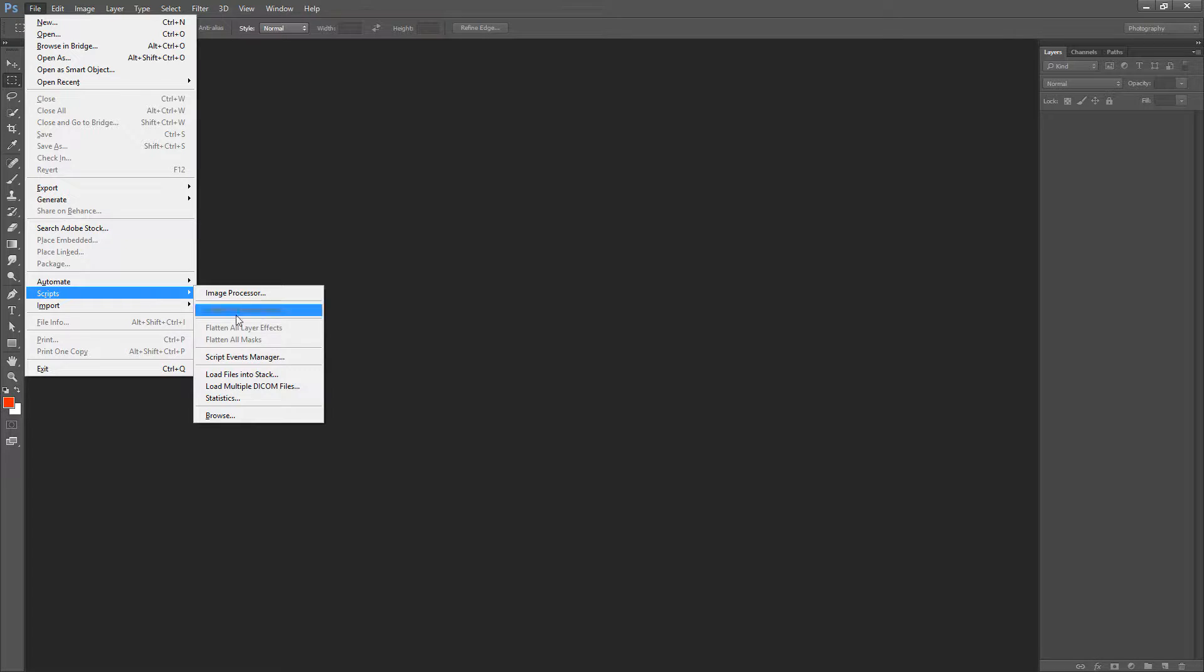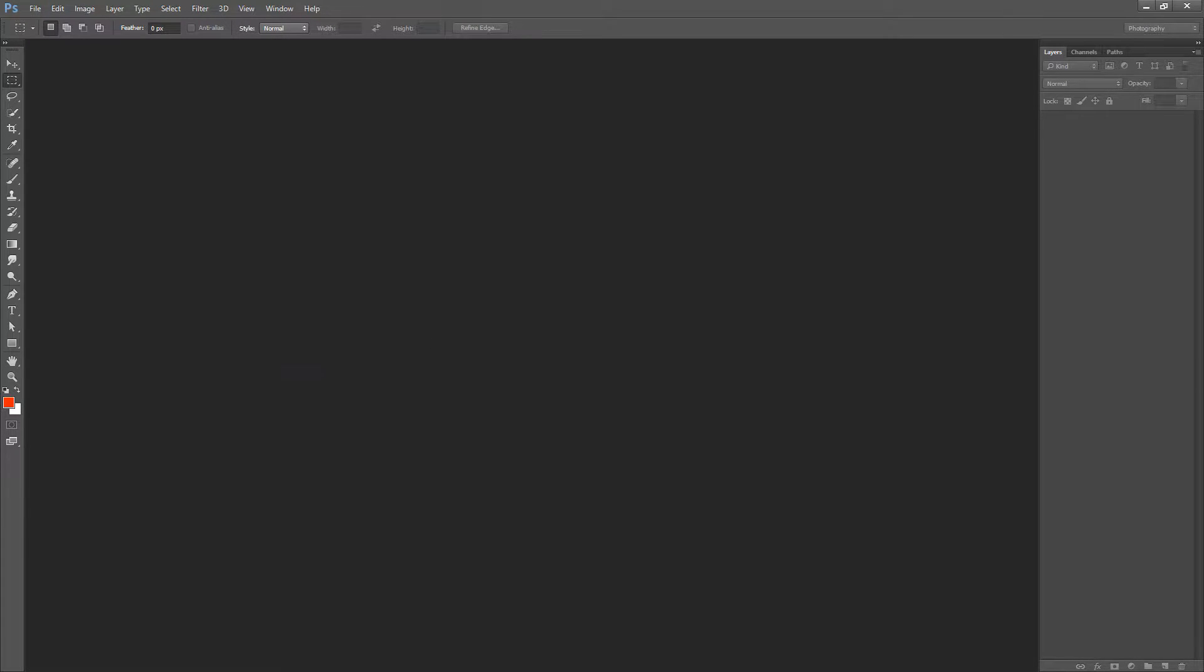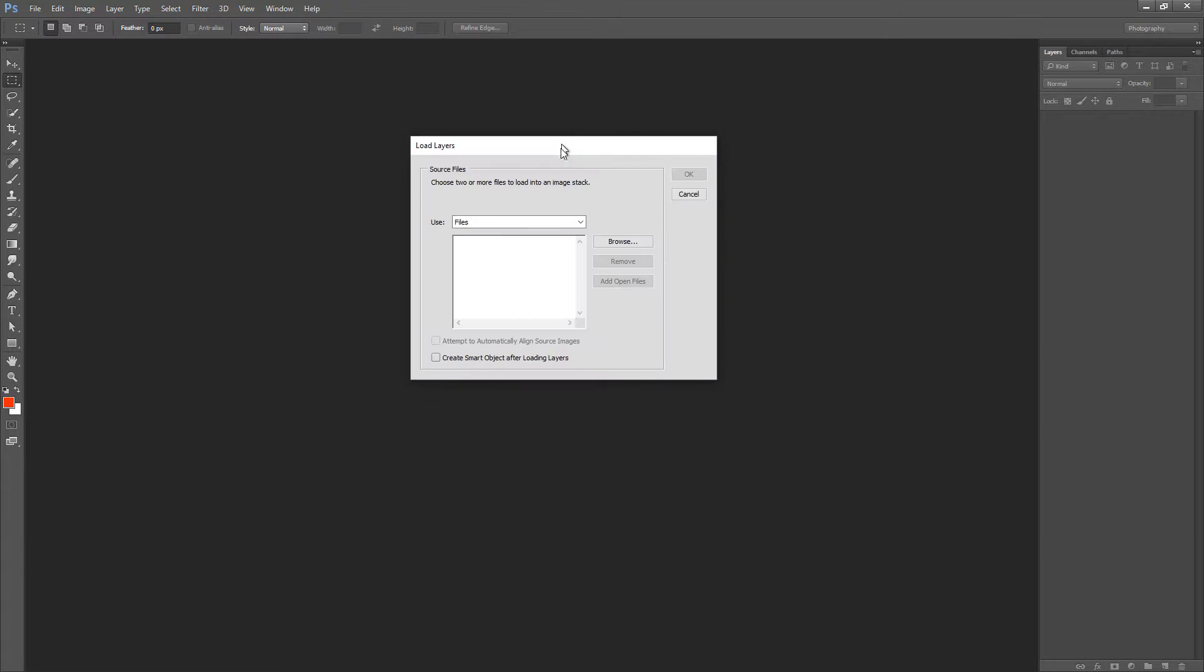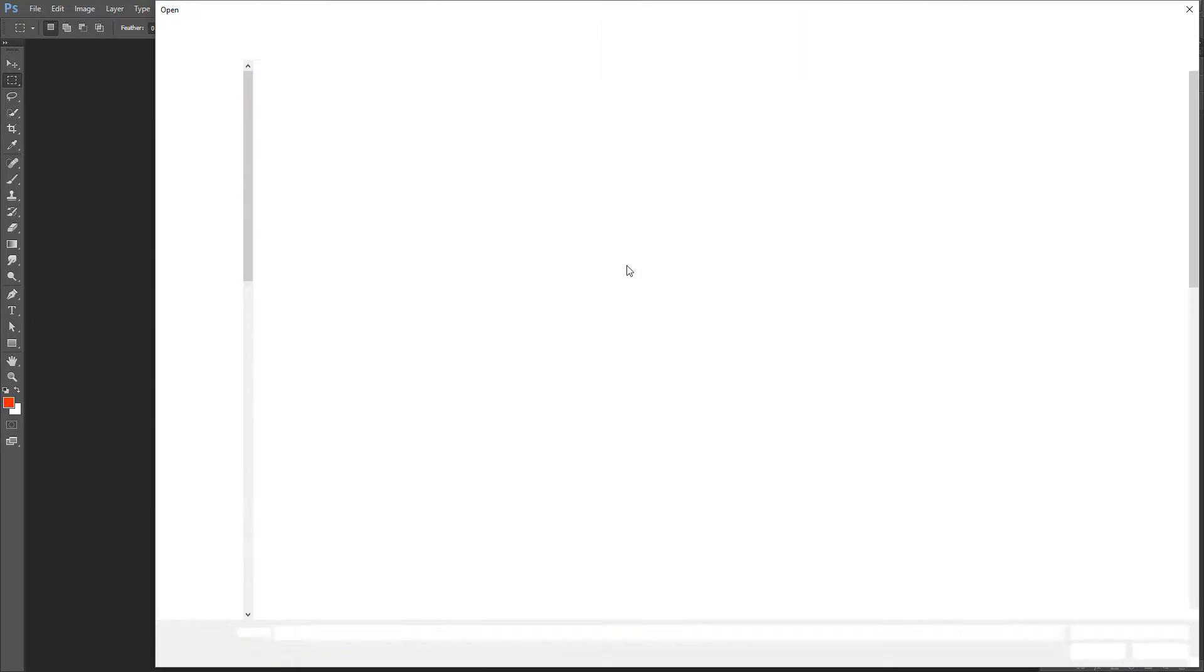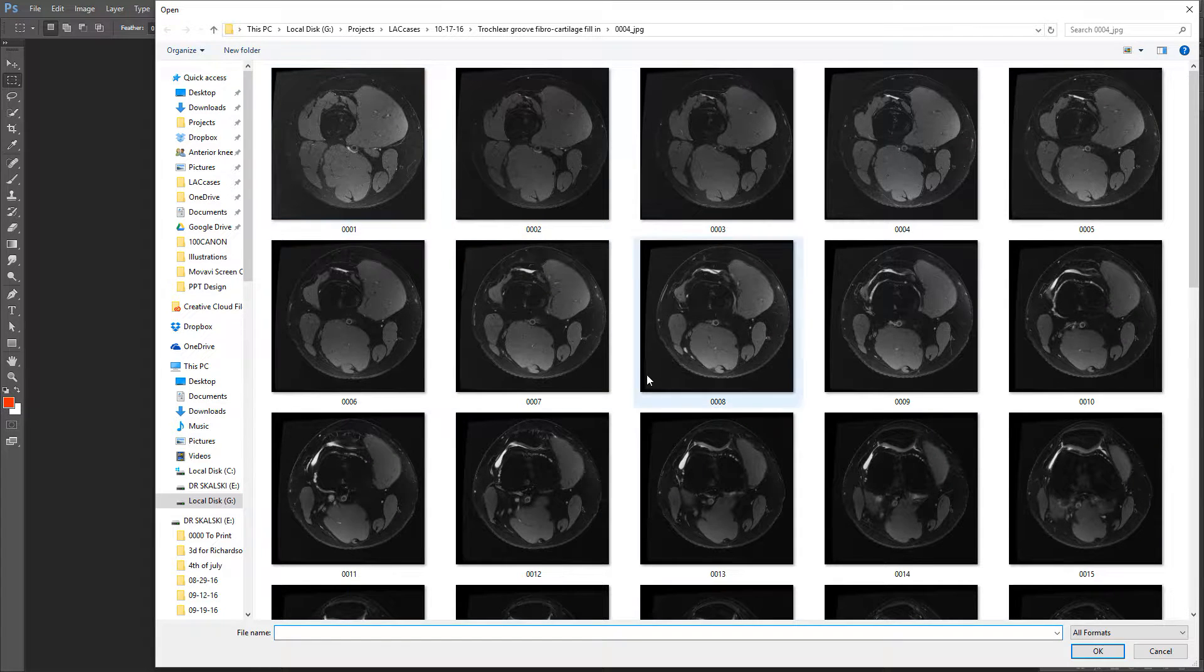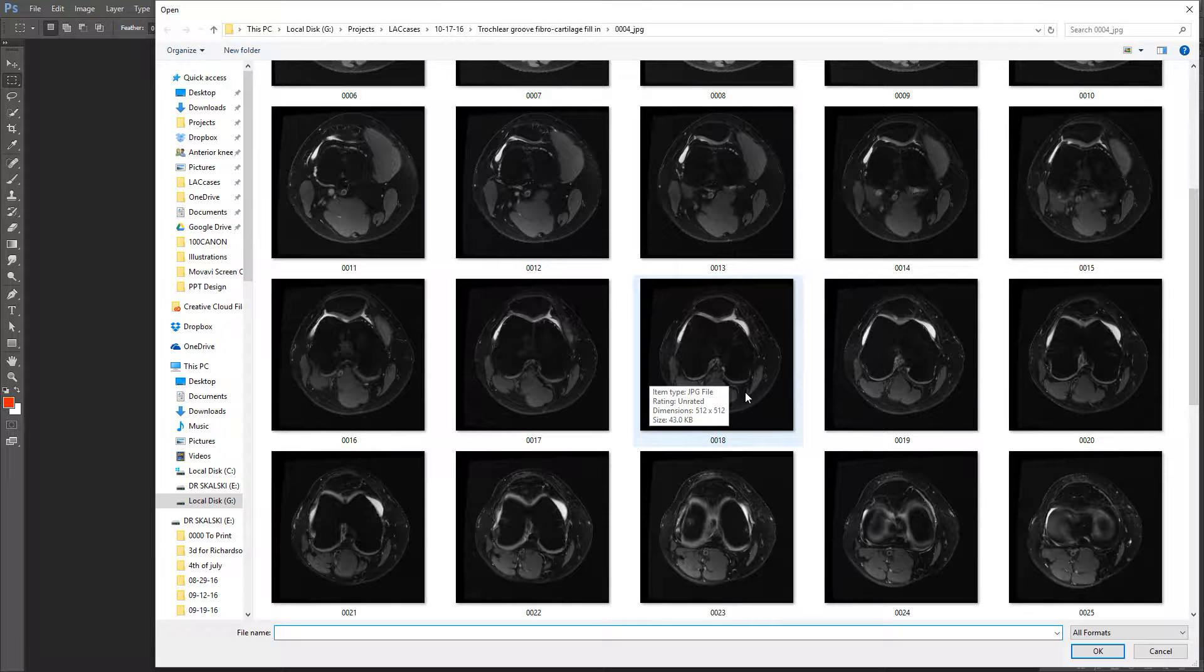If you go to File, Scripts, and then you come down here to Load Files into Stack, it'll open up this dialog box and then you can go to Browse and select the images you want.